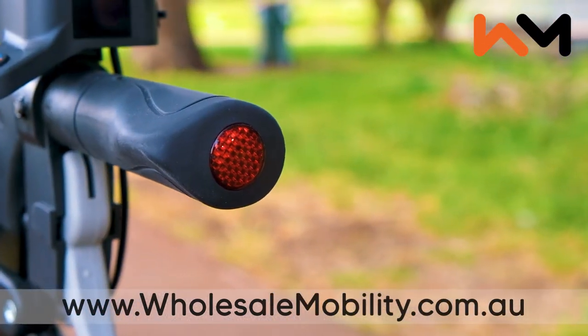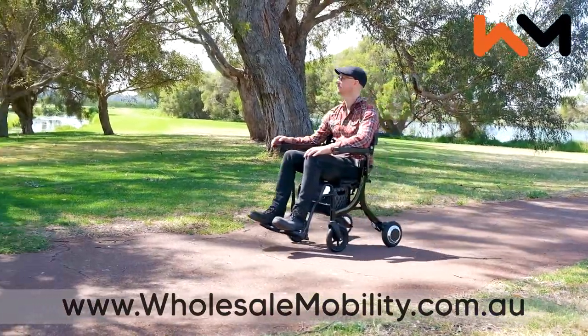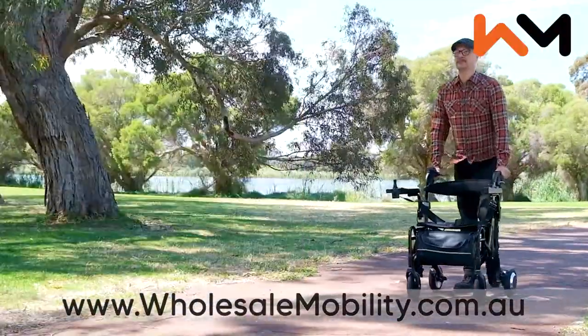There are also added reflectors and a seat belt for additional safety. Whether you use your eTraveler Evo as a lightweight electric wheelchair, a push assist wheelchair, or as a rollator, we are sure you will be as impressed as we are.